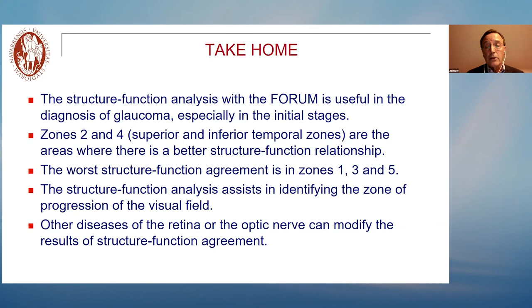This analysis helps to identify the areas in which the functional damage is likely to progress. Keep in mind that other retinal or optic disc alterations can modify the results of this analysis.